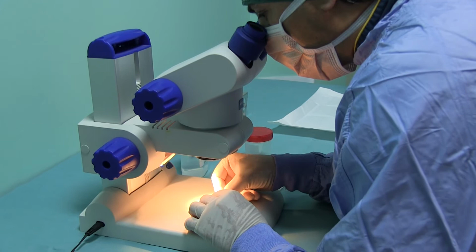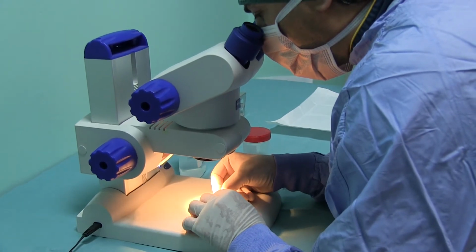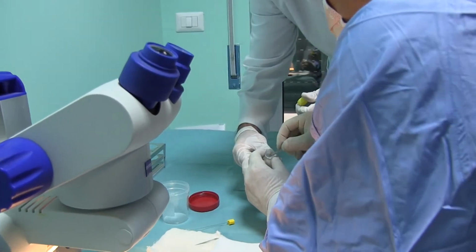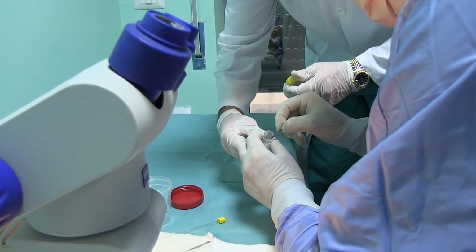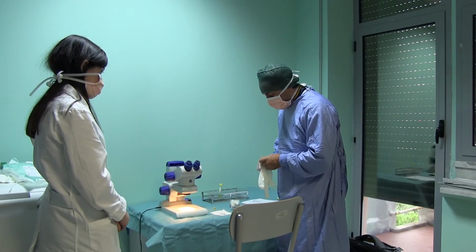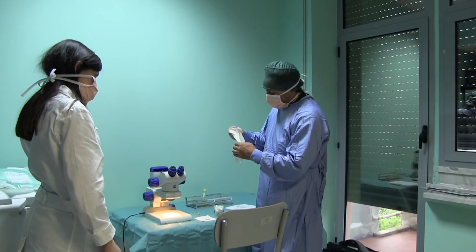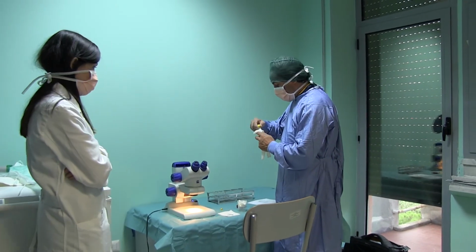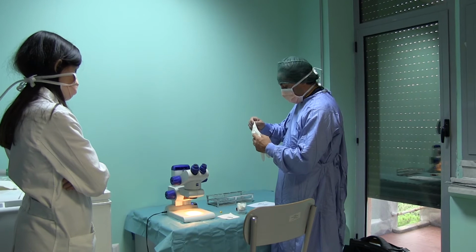Once the adequacy of the core biopsy has been evaluated, it is divided into 3 samples in order to make the correct diagnosis of kidney disease. These procedures are light microscopy, immunofluorescence, and, where possible, electron microscopy.